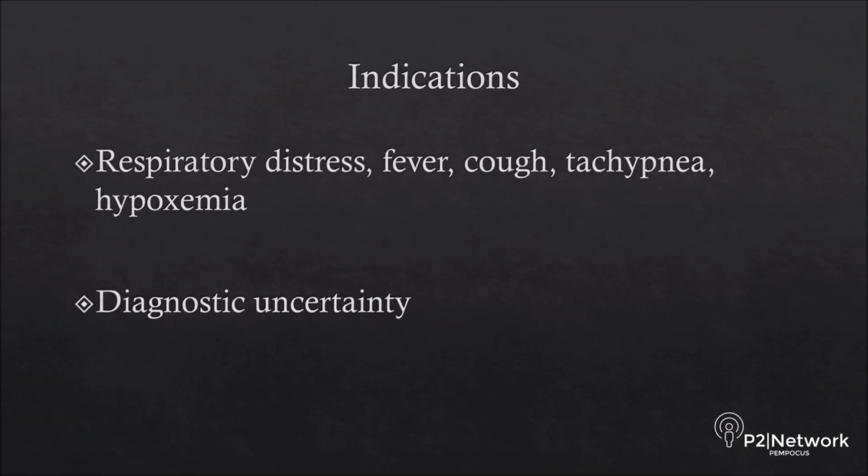You can perform a lung ultrasound for tons of indications, but most common are significant respiratory distress, fever, cough, tachypnea, and hypoxemia, and when you're really not sure of the diagnosis.